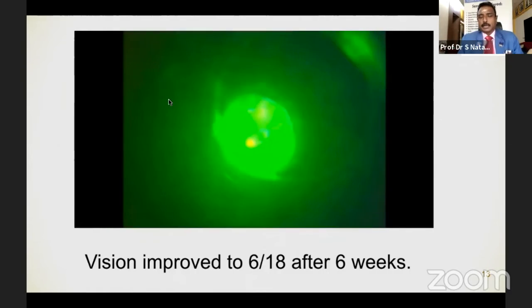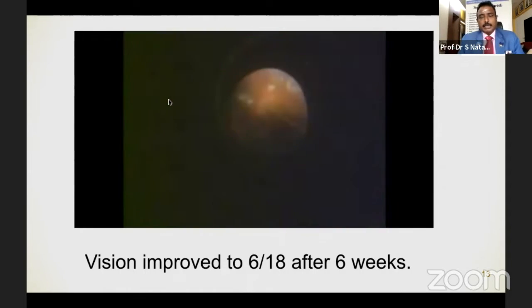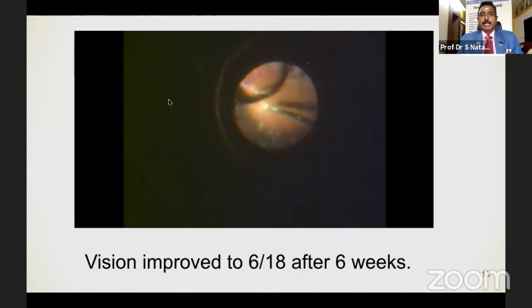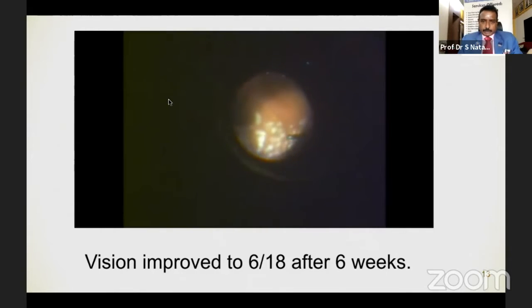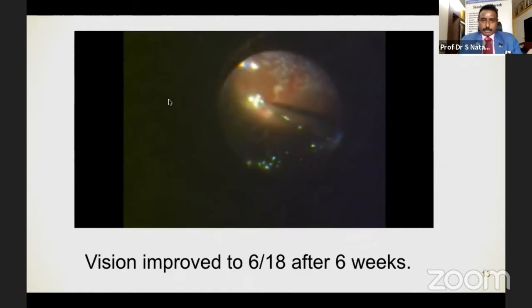In this sort of eyes, where you cannot give anti-VEGF pre-op, we do the vitrectomy, and at the conclusion we give the anti-VEGF, and again at the end of 1 month if required, performing OCT and angiography. If needed, you enhance with further laser photocoagulation as well as anti-VEGF injection. So you can see fluid air exchange done, and that's the advantage of using the BIOM or any other wide angle system where you can work under air.